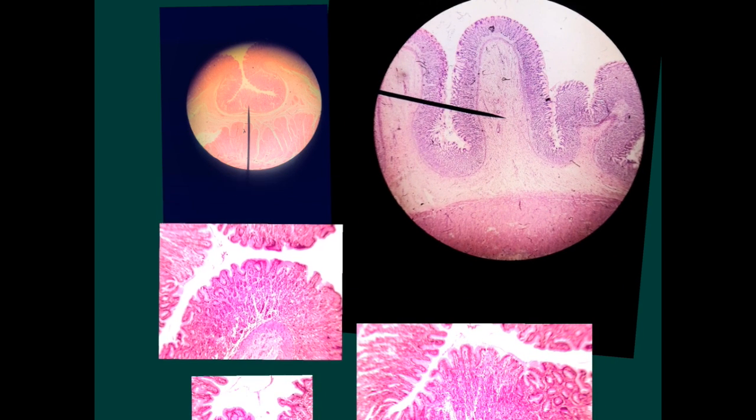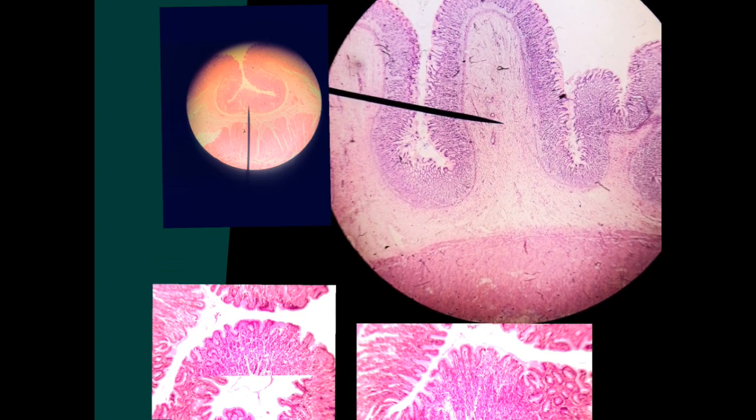Starting with the fundus, it is characterized by having a folded mucosa, and then a pale area of the submucosa, then the musculosa. Folded mucosa, submucosa, and the musculosa. By looking at the slide here, you will notice that it has the pits about 1/3 of the mucosa or 1/4 of the mucosa, and the folds are very evident. This is the muscularis mucosa, submucosa, and the muscle.